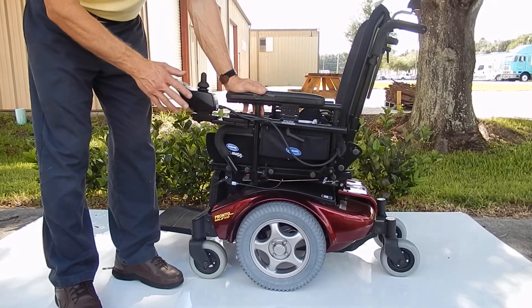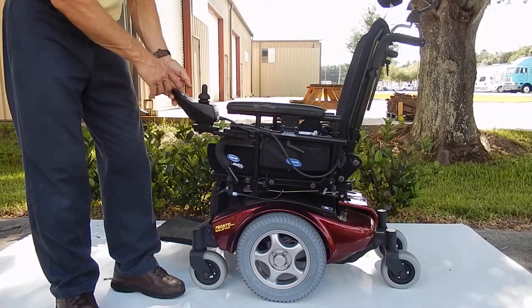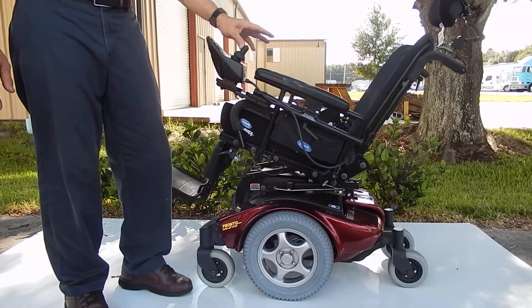This chair has an electric tilt. To make the tilt go up, there's a button on the joystick, and you hit the button, and then you push the joystick forward or backward. Backward — there's your electric tilt.